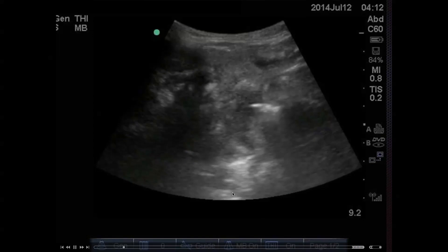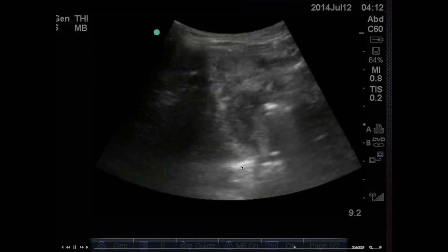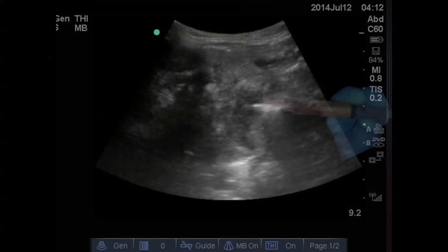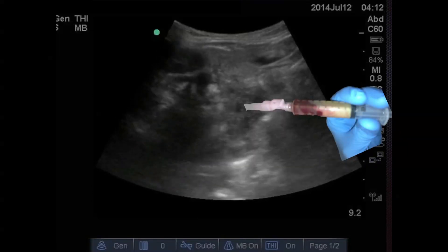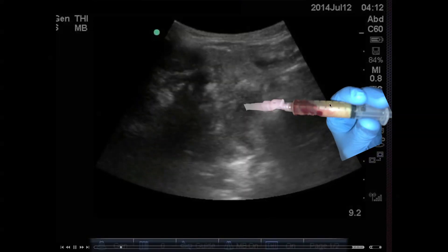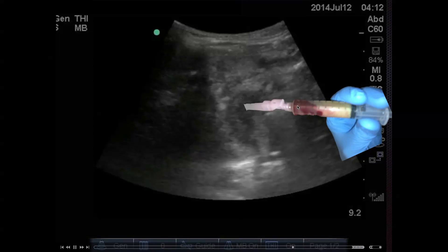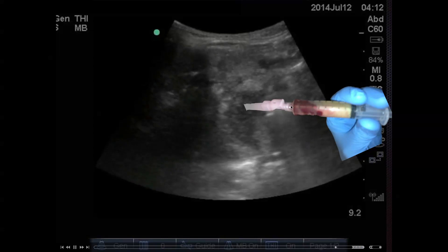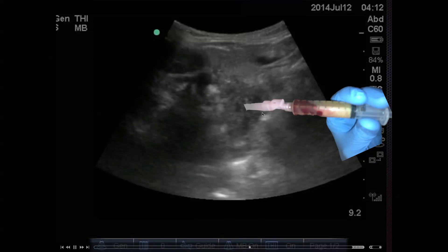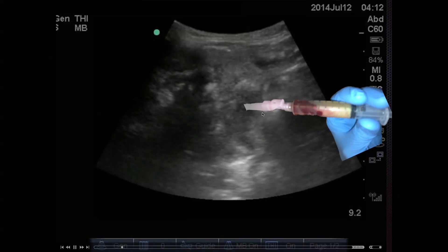The patient was quite comfortable and we were all able to watch the needle the whole time. Once he aspirated and removed the needle, we actually got about 10 cc's of purulent material. Got a little blood at the end. It kept squirting out the mouth, hitting us in the face. It was very pulsatile. And the patient syncopized. [Laughing] No, I'm kidding.